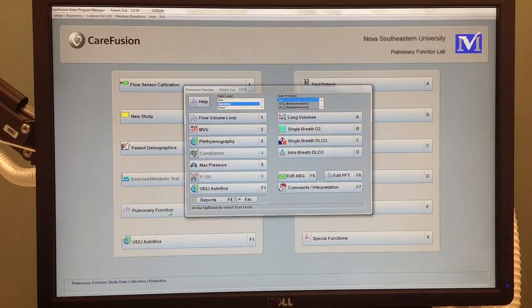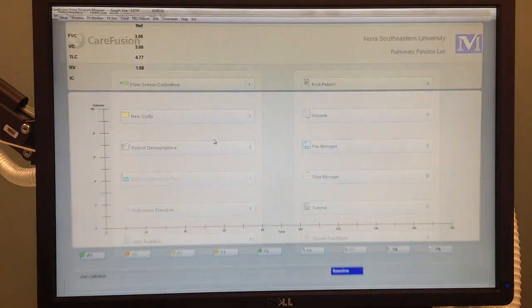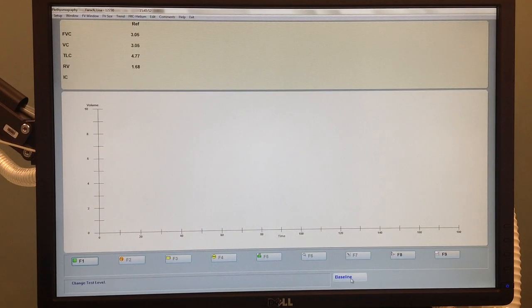So we're going to go pulmonary function test, then go to number 3, plethysmography. And this screen comes up, and you notice I have this on baseline. So in order to start the data collection, I need to hit F1. Okay, go ahead and put your nose clips on. Put the mouthpiece on and start breathing.